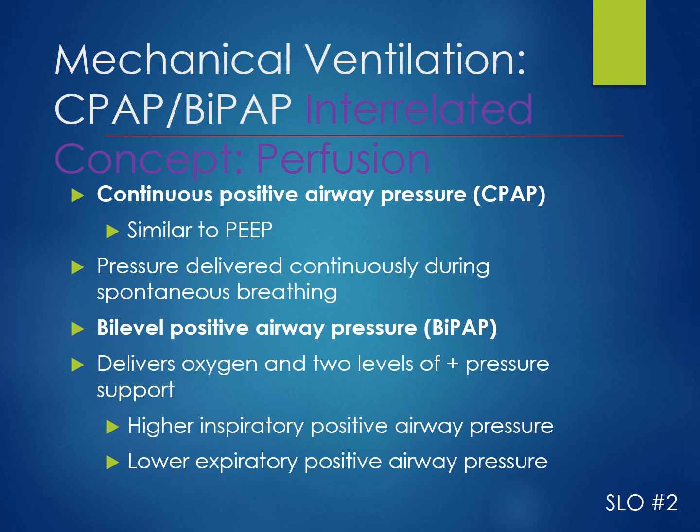Okay, so another mode that we're going to see used, which can be used invasively on an ET tube or non-invasively, is CPAP and BiPAP. CPAP is a little bit more support. With that continuous airway pressure, it's constantly blowing air into the patient, keeping those alveoli open. So it mimics PEEP. That PEEP never allows the pressure to drop to zero. CPAP is the same thing.